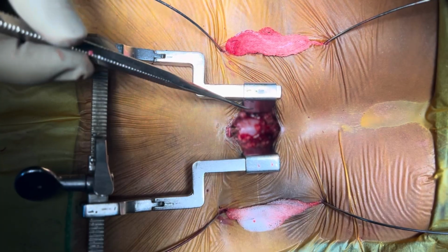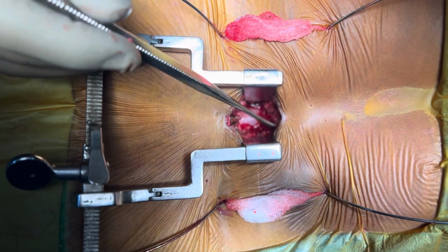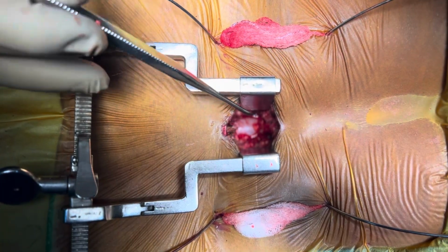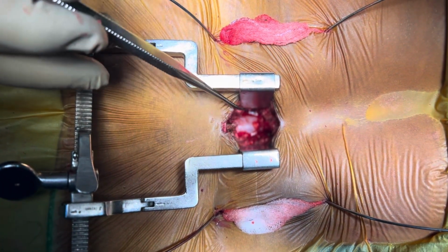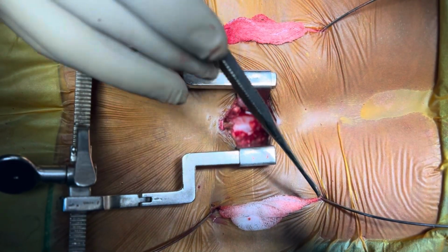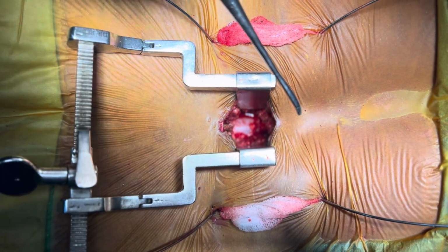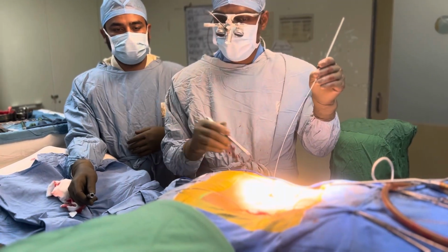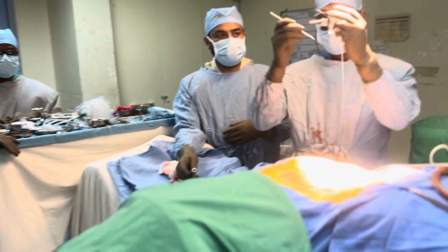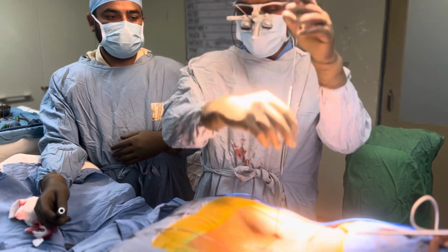We have done the interbody work and decompression through this midline 2 cm incision. It is an incision as good as we take for a microdiscectomy, and now we are going to close it and put the pedicle screws through these guide wires. The C-arm is in a lateral position, and everything needs to be done with the C-arm in a lateral position only now.